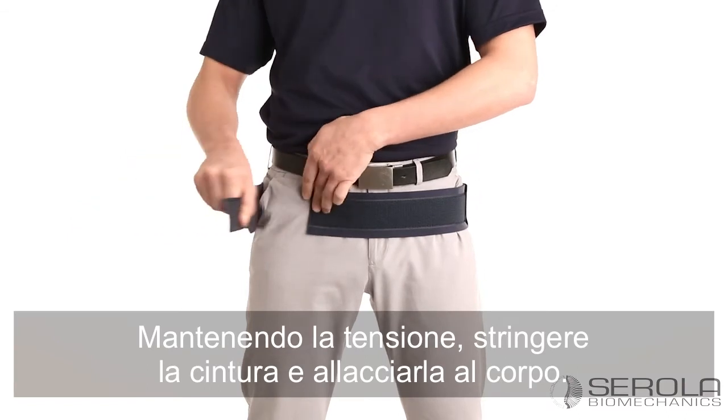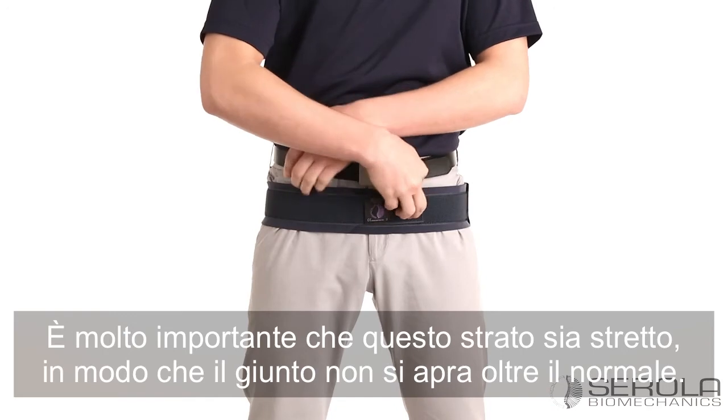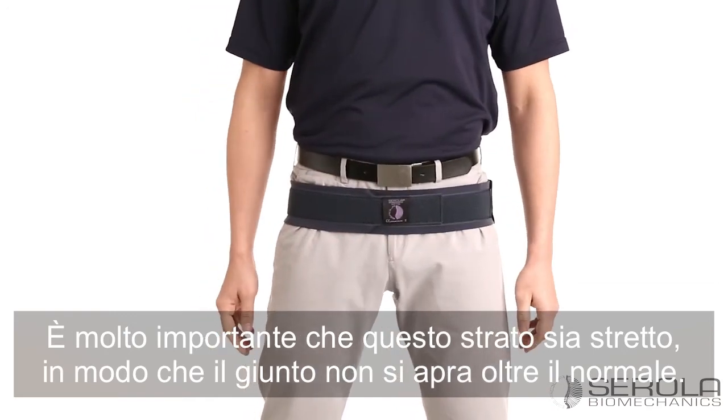While maintaining tension, pull the belt around and fasten. It is very important that this layer is snug so the joint doesn't open up beyond normal.